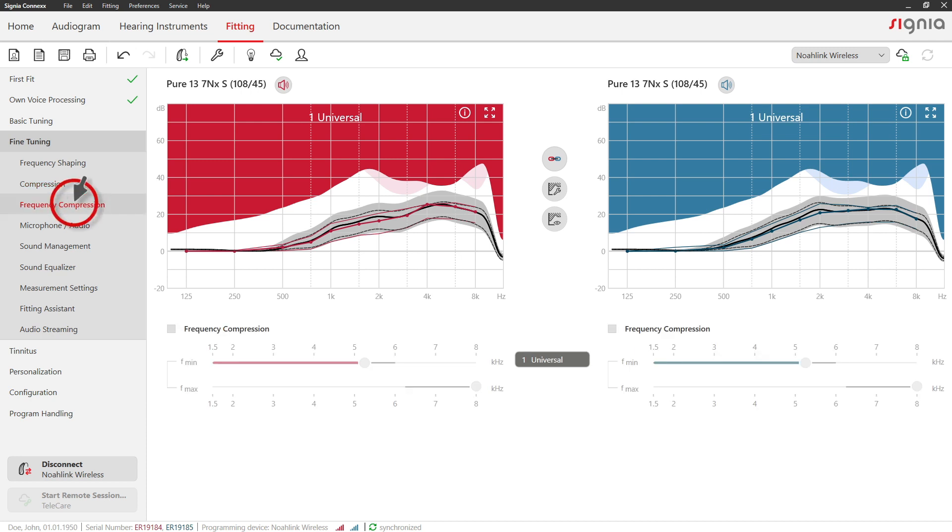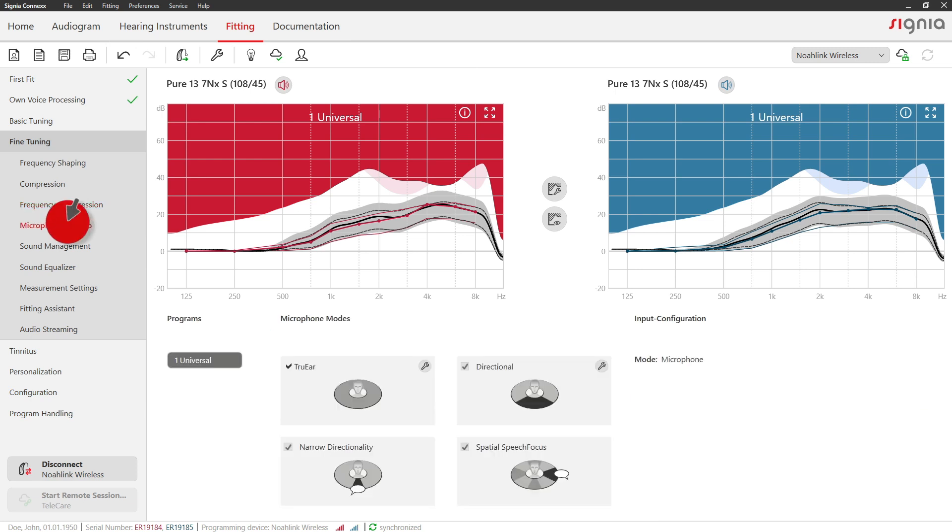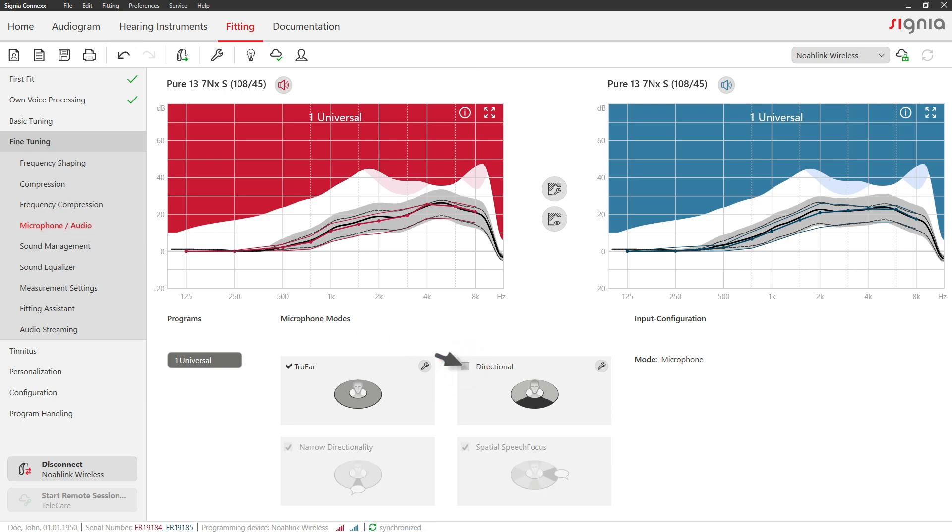In case frequency compression is recommended for your client's hearing loss, it will be activated automatically and you can optimize the settings in this section if necessary. To access microphone settings, go to the Microphone Audio tab. Activate or deactivate microphone modes with the respective checkbox.